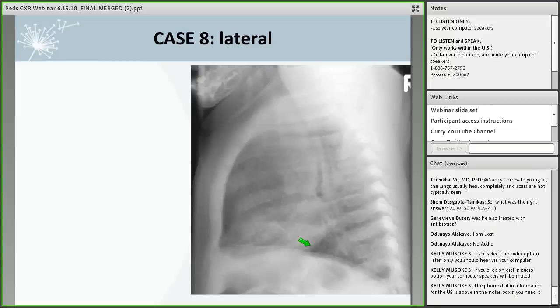So in addition to the skin test or IGRA test, the chest radiograph, you also want to obtain a good history and physical exam, because sometimes the chest radiograph alone doesn't help you. And you want to also read that chest radiograph as soon as possible. Again, the highest risk of TB disease is in the youngest babies.